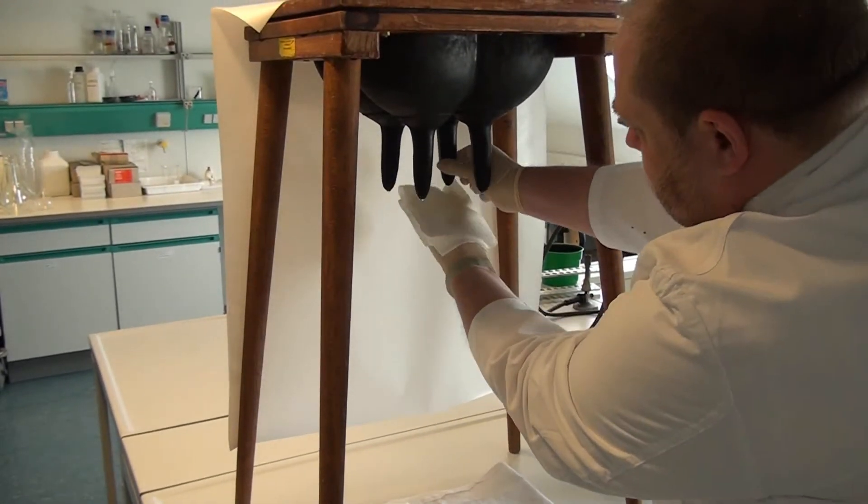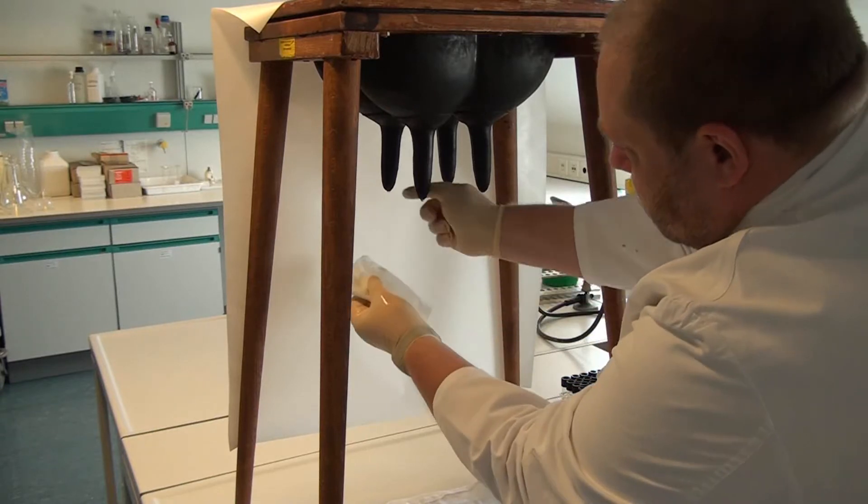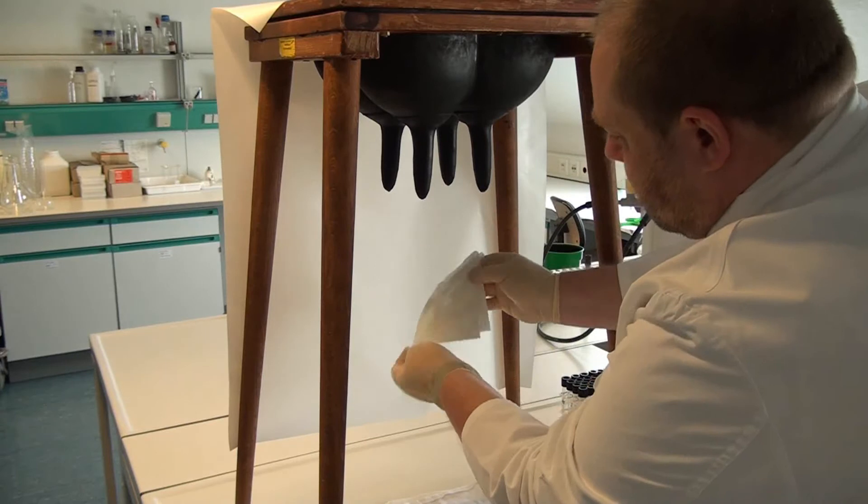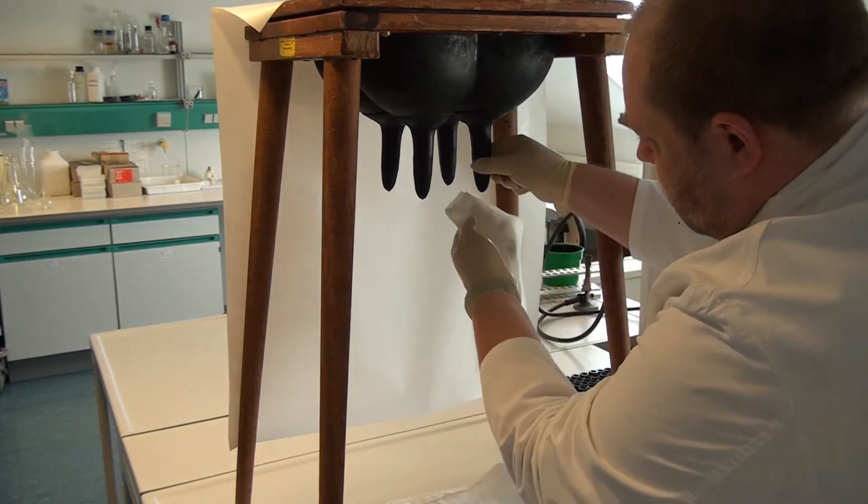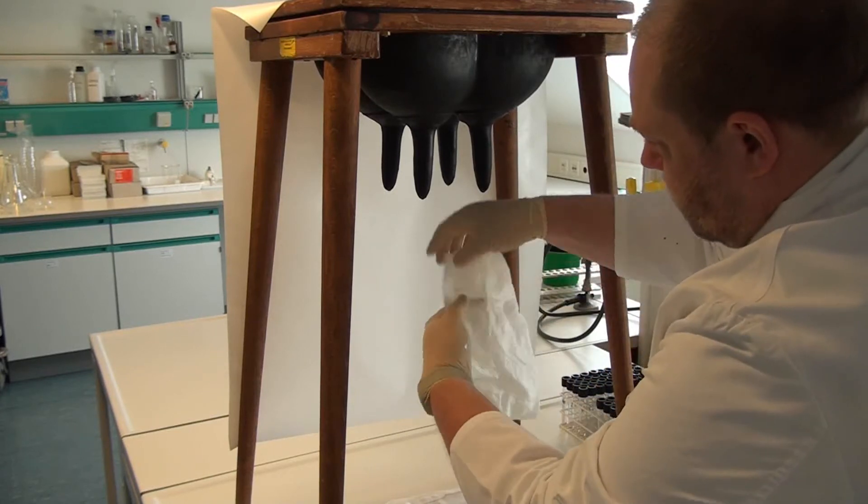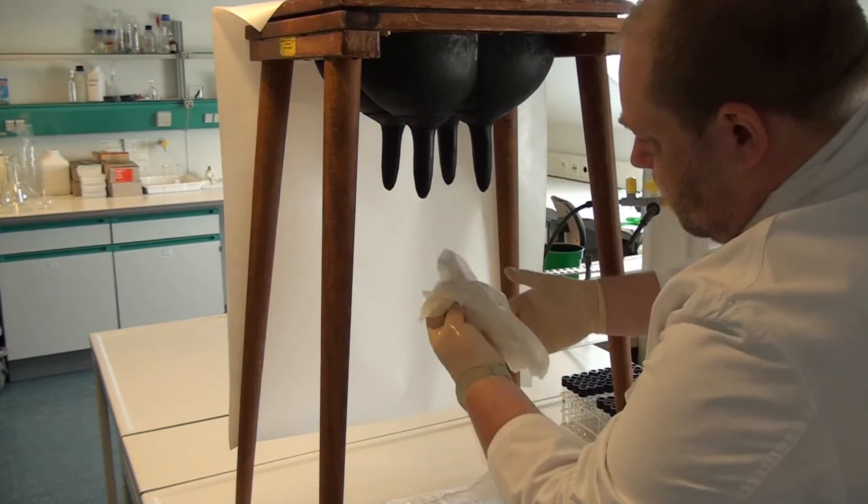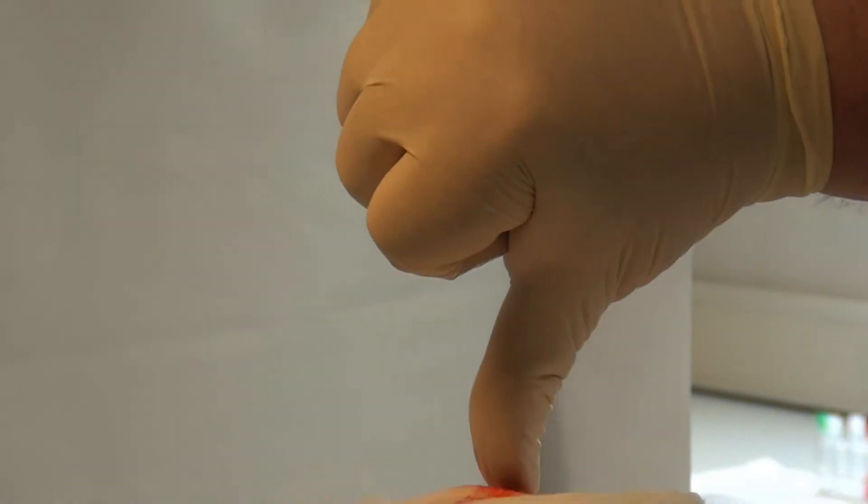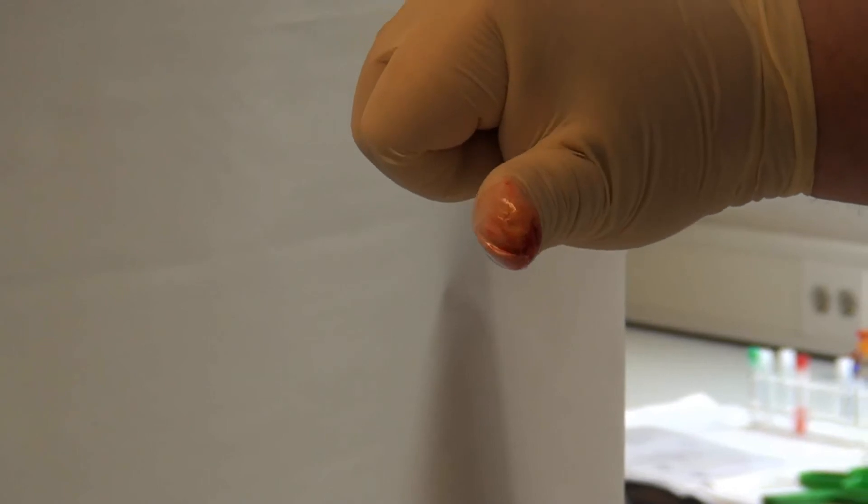It's important for the operator to start disinfection with the opposing quarters in order to avoid contamination with his or her hands. Using a stain solution, the areas which are disinfected become visible. The goal is to disinfect the tip of the teat with circular movements and to also include the teat canal.